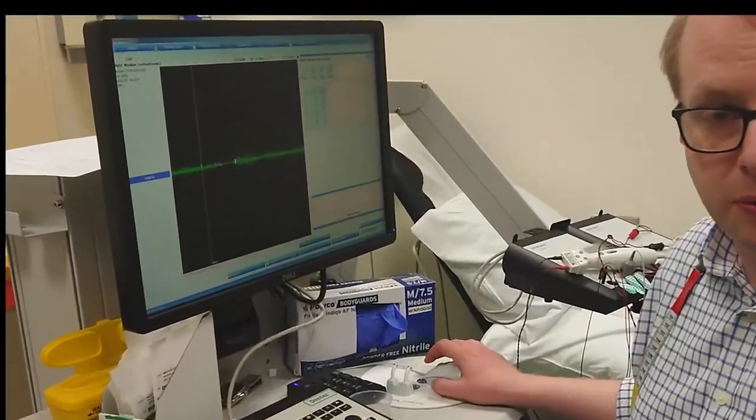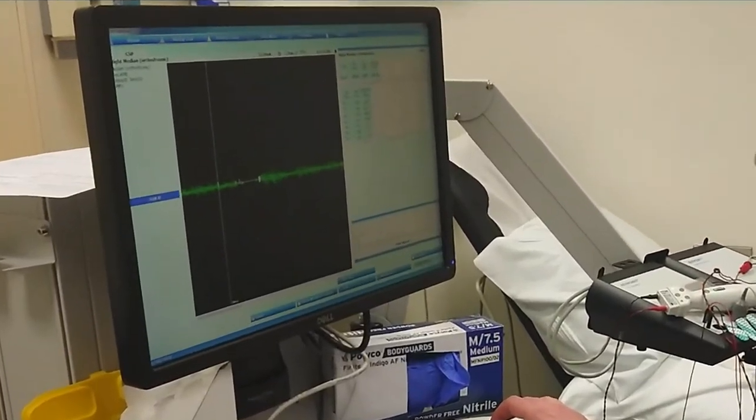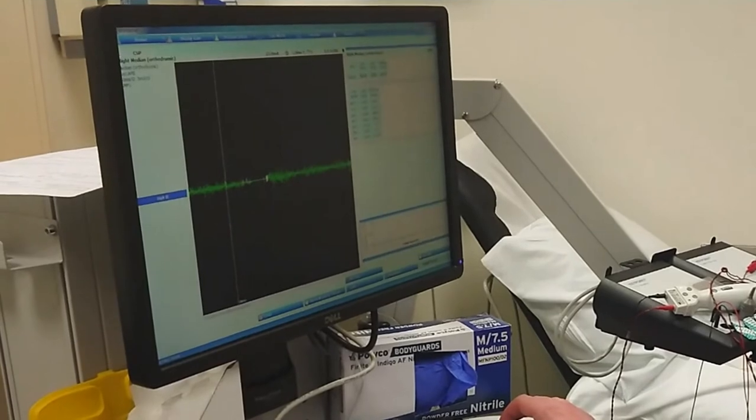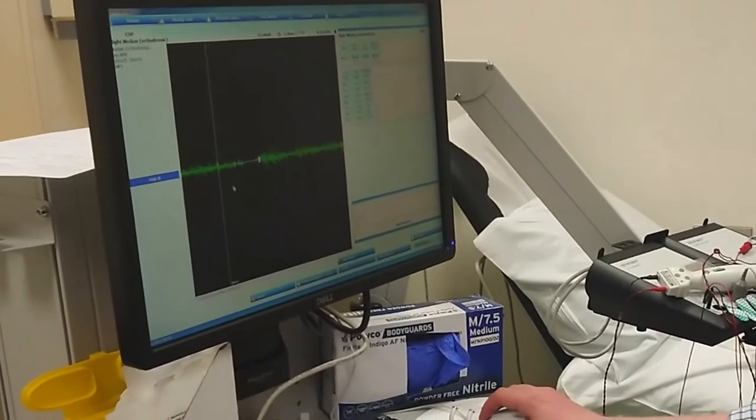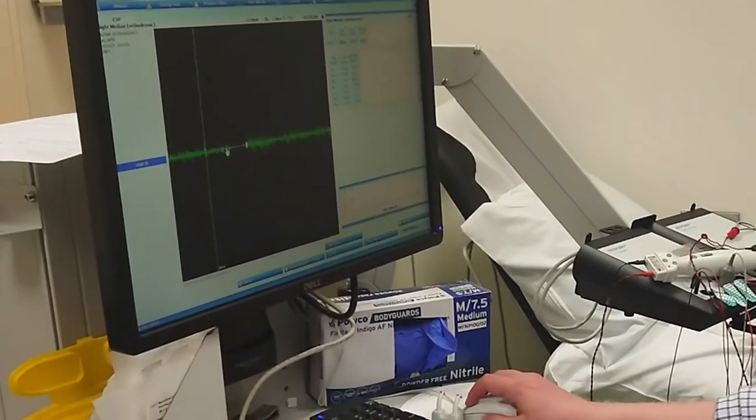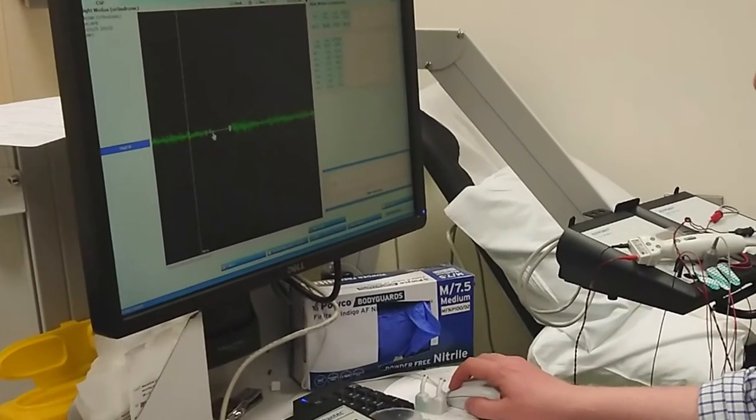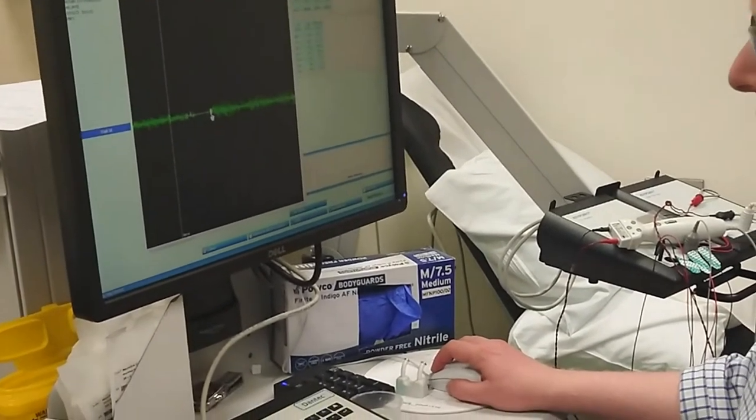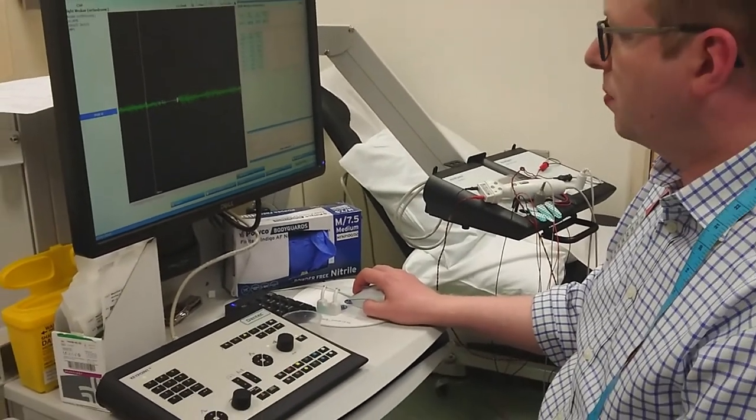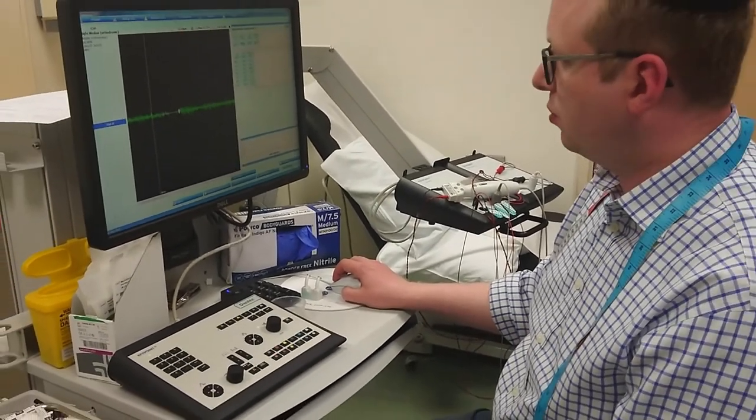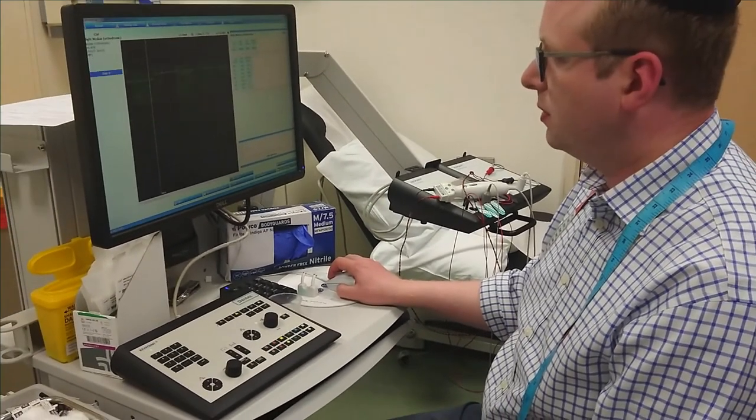Now, sometimes it can be quite useful to superimpose the traces so that you can see very clearly where the silent period really is. And you can do that just by clicking the superimpose.